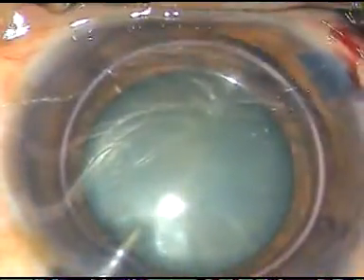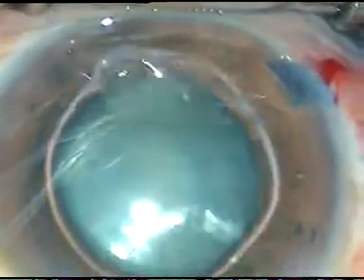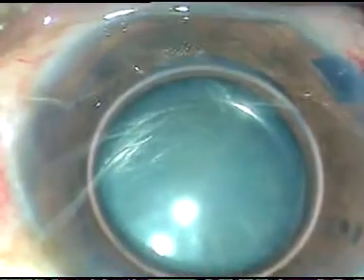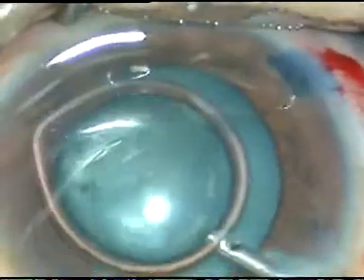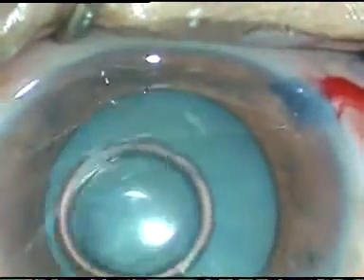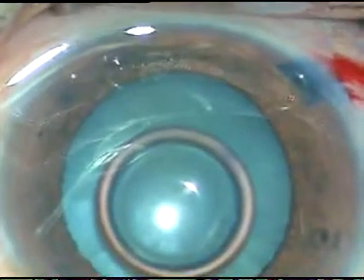This is a little bit of adrenaline to see if the pupil dilates a little more. The pupil has dilated, but not fully in this case. And we see that after application of adrenaline, the pupil has dilated a little more.